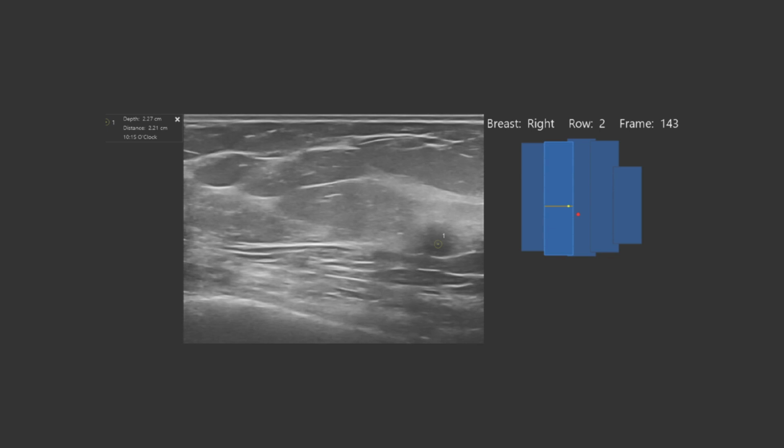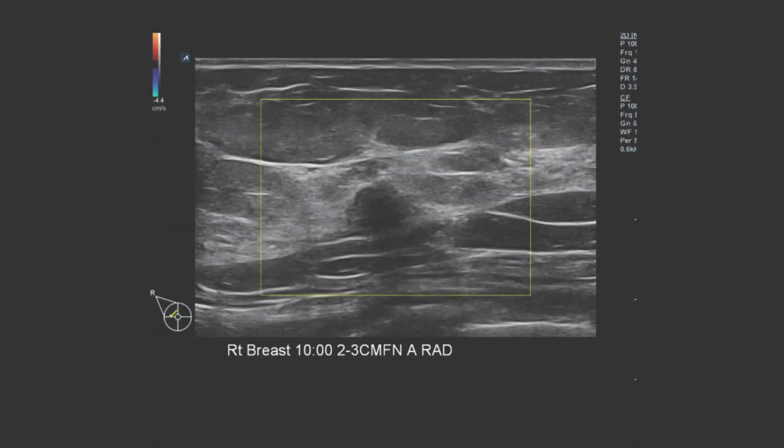So we're looking at a transverse image here, and you can see on the image there's a yellow circle that's marking a dark spot. So that was called back for further evaluation, so a BI-RADS 0. And then on the diagnostic exam, which can include looking at that area from different angles and different positioning, as well as looking at it with color images, that dark spot persists. That was a mass, and that turned out to be a cancer that was found on this screening ultrasound.